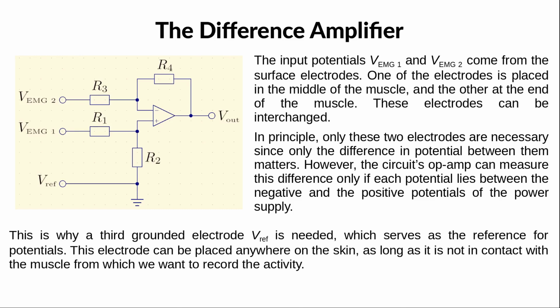It has two input potentials, VEMG1 and VEMG2, that come from the surface electrodes connected to the muscle. One of the electrodes, it doesn't matter which one, is connected in the middle of the muscle, the other is connected at the end of the muscle. What needs to be measured is the potential difference between the two electrodes, so in principle it doesn't matter what the reference potential is. However, OpAmps can measure the difference between two potentials only if their values lie between the negative and the positive potentials of the power supply.